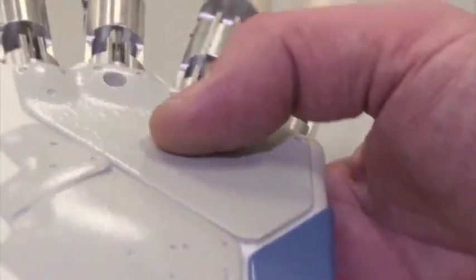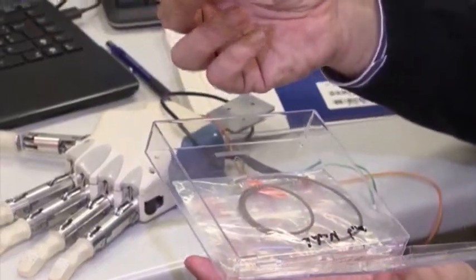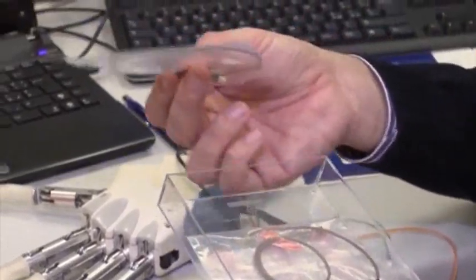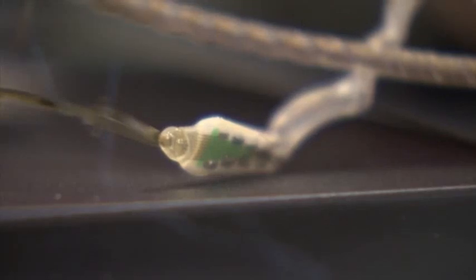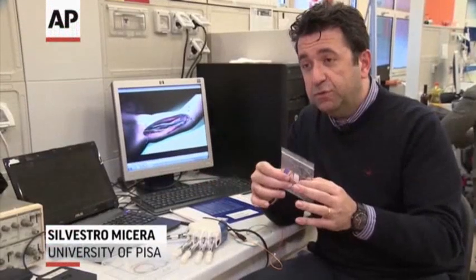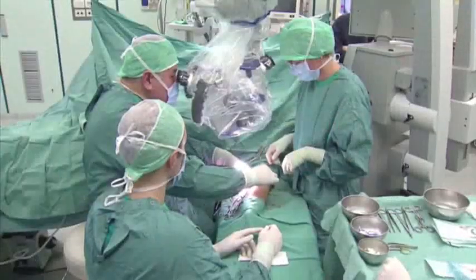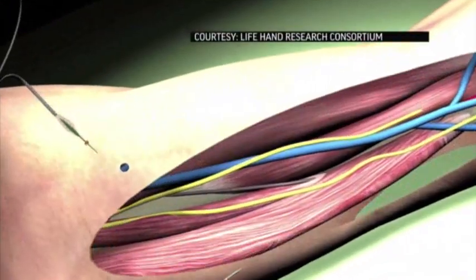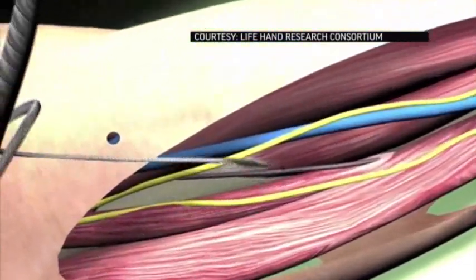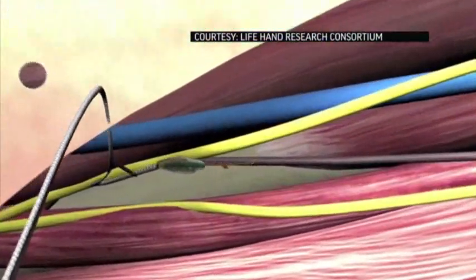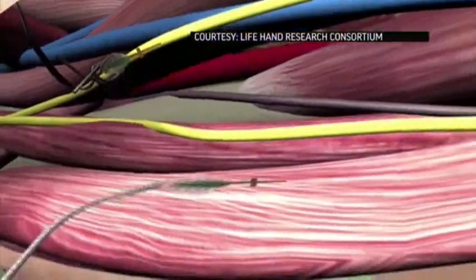Researchers at Gemelli Hospital in Rome are developing the technology, an electrical link between the prosthetic and the brain that gives the user a sense of touch. First, the electrodes will be implanted long term. The hand works by running wiring that would have been connected to the nerves in the hand to sensors in the fingers of the prosthetic. Similar research is also being done at universities in the U.S.